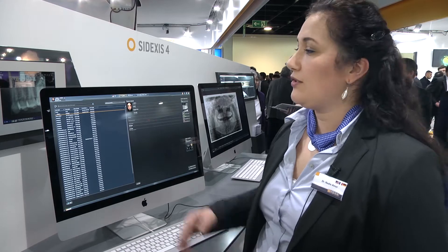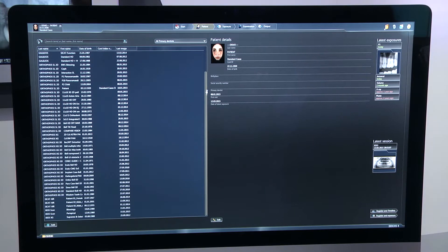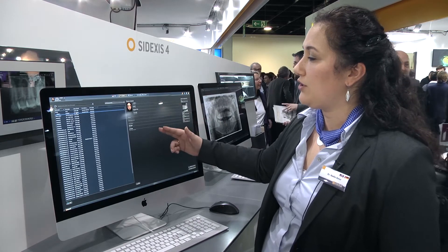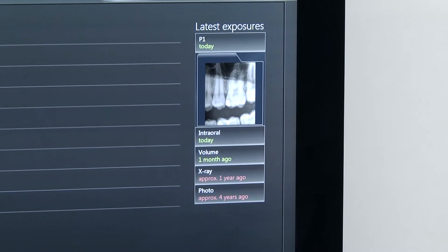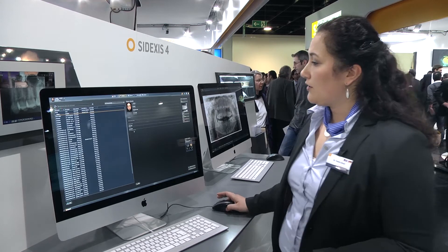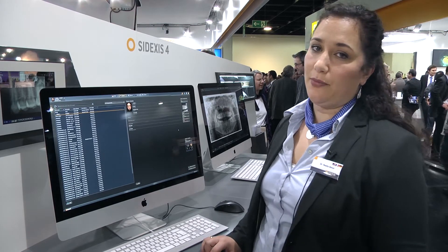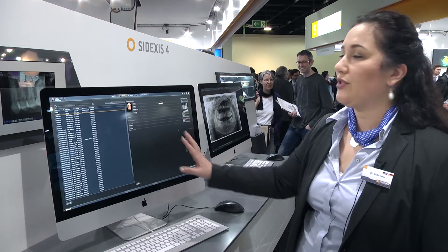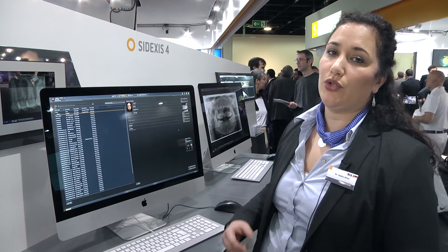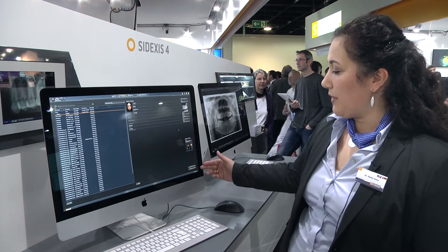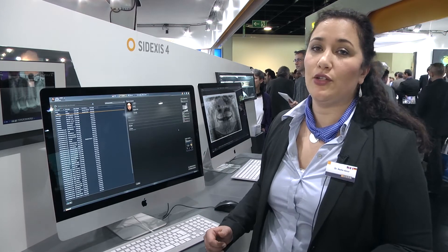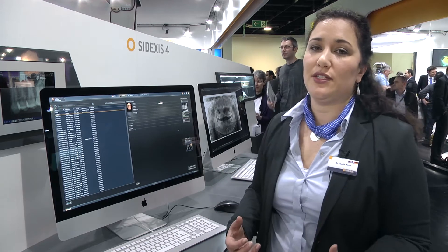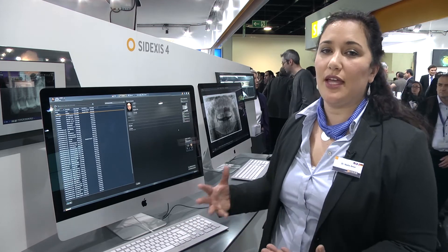Starting in the patient phase, you see the whole patient database that you have in your office and you can select a patient very quickly. You get an overview of which patient you selected — you see all the patient details plus you directly see the latest exposures of each image type. The navigation is very simple: you always find a next button in the lower right. We have one button to register the patient and go to exposure if you want to take a new image, and on the other hand you can register the patient and directly see all the existing images of that particular patient.